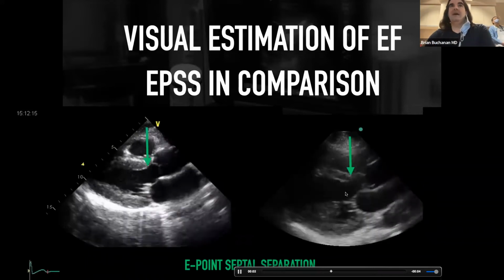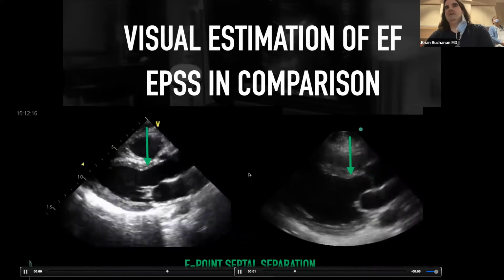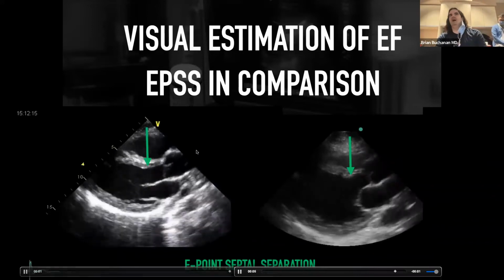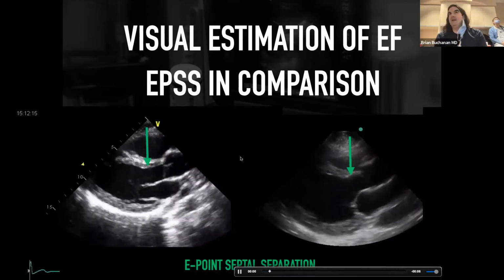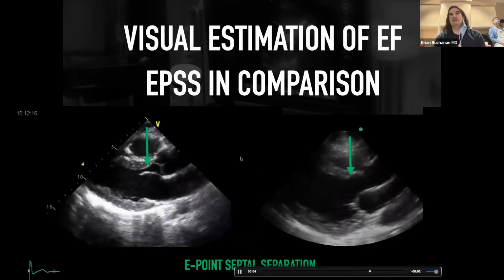So just to be aware that this technique, while I think good from a point of care standpoint, has a lot of limitations. That's why by itself, I wouldn't rely on it. But certainly looking at myocardial thickening and then endocardial excursion coming in are all really important parts of looking at the ventricle.